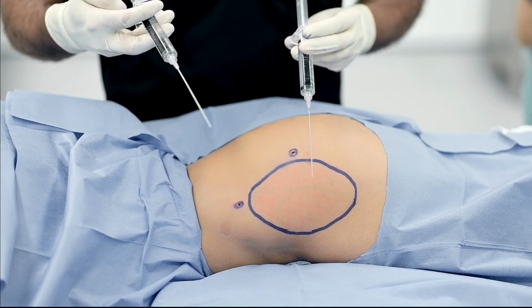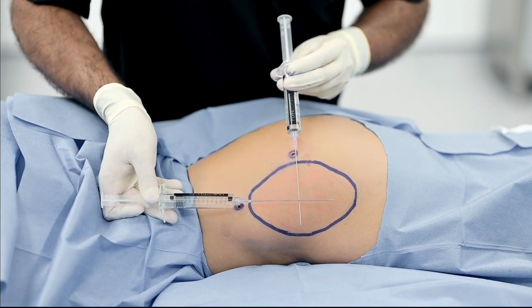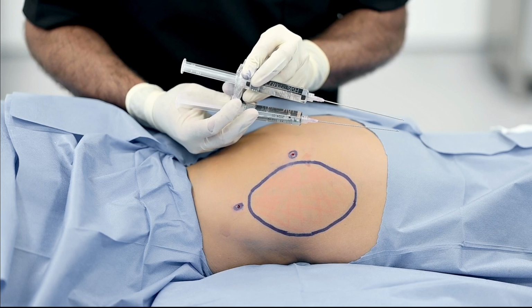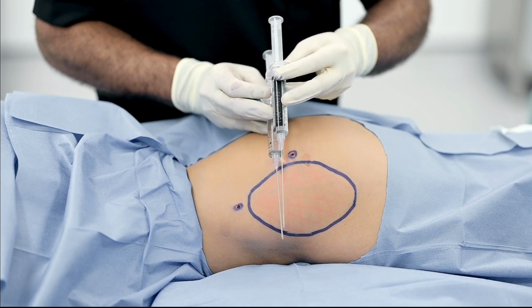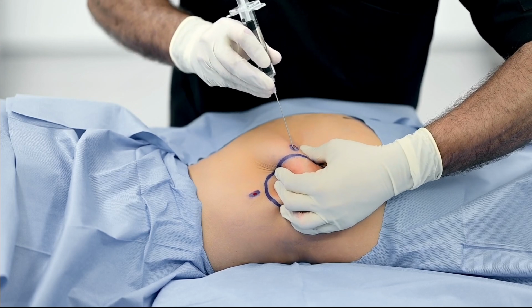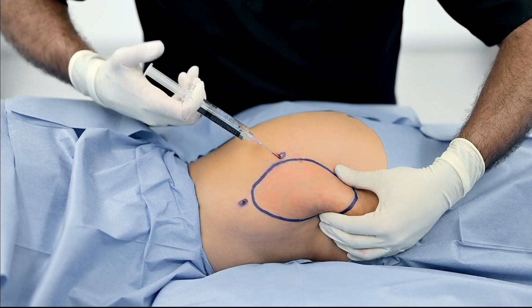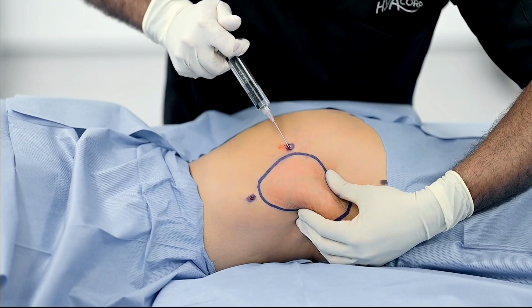So again, same technique. We will use these two entry points with perpendicular injection and two layers of injection, deep and superficial. Deep and superficial. So we are going to start the injection by this medial port. We pinch. This way we have the access to the deep fat. So this is first of all a deep injection.